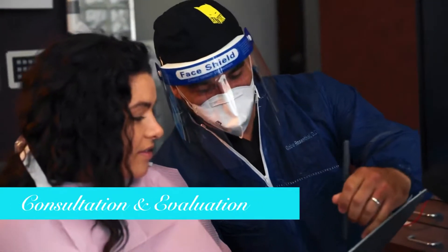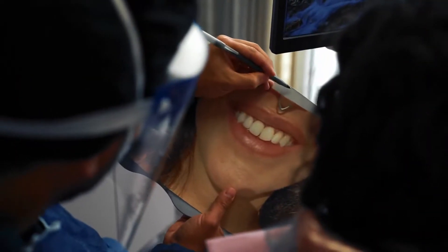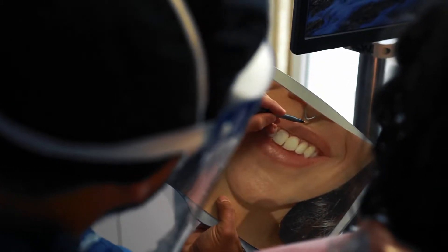Okay, here's what we're doing. So when you smile, you see how the gums are a little bit uneven right there? We're going to follow your bite line, so you go from between your eyes down to your philtrum.